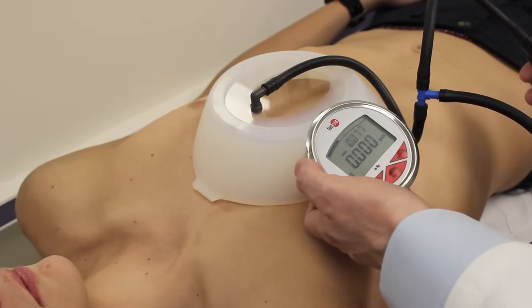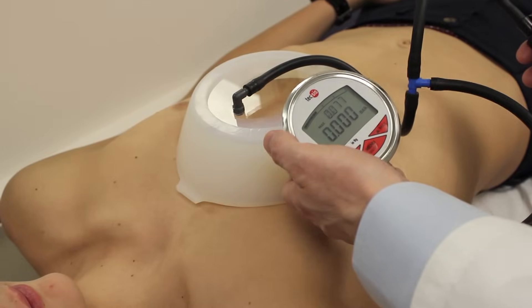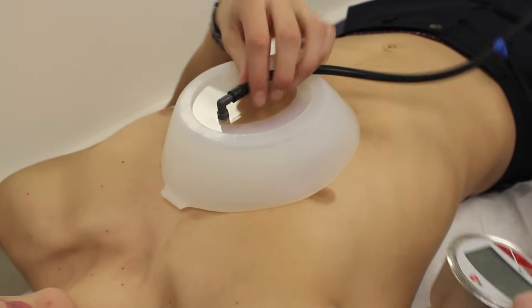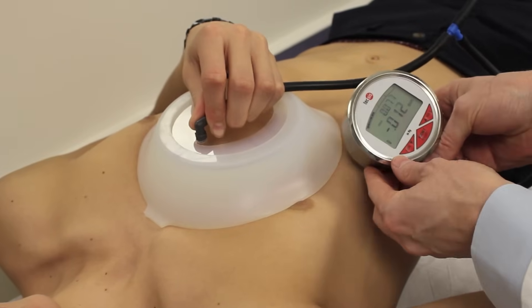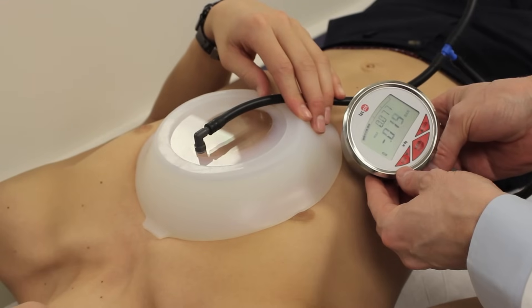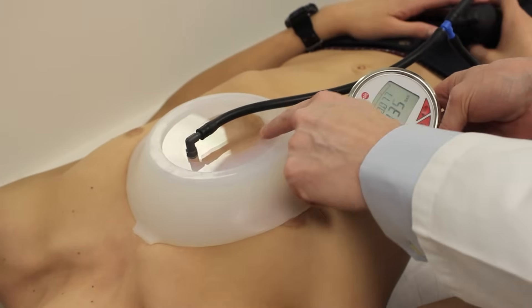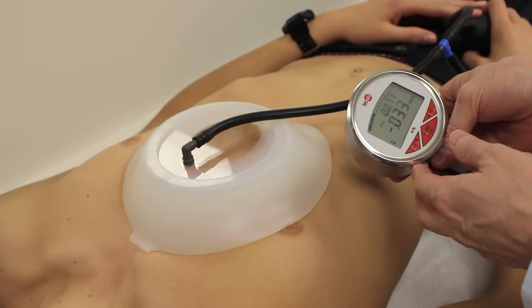Now we will have the patient apply vacuum pressure, and we'll measure it with this pressure gauge to make sure we're staying in a safe range. Go ahead and grab the pump, push down, and apply — one pump, another, another, and another pump, four pumps total. That puts them in a very safe range, and we can see the chest wall lift here underneath the glass from the vacuum bell.